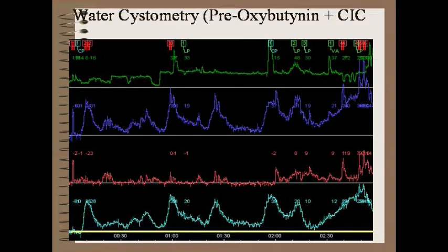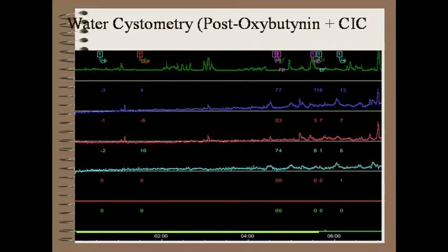So this is the picture. This is the detrusor contractions. You can see the detrusor contracting every 5 mL of water filling, and the same after giving oxybutynin. She had a fantastic response to oral oxybutynin.